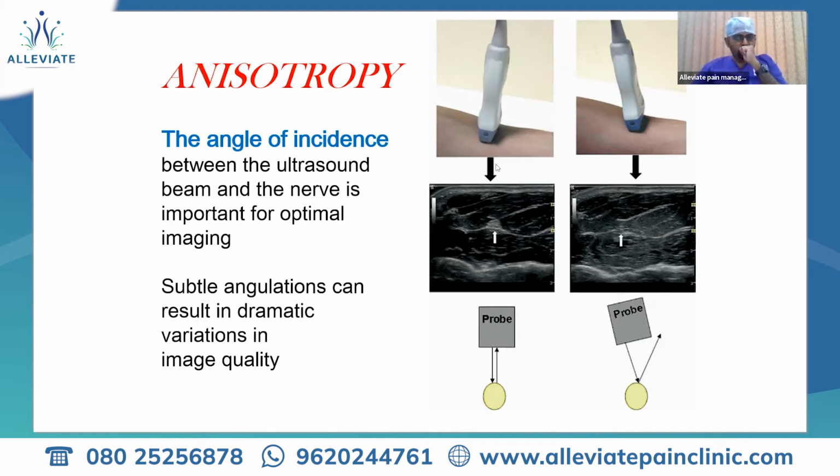So this is the structure of interest. This is a probe which is placed on the skin surface, exactly perpendicular to the axis of the structure, so that the incident beams and the reflected beams are equally received by the probe.